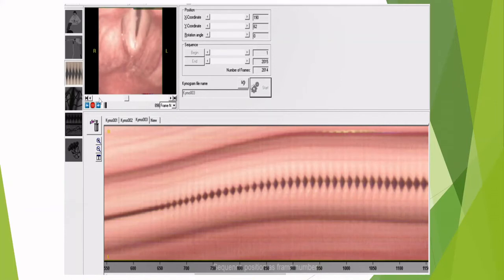We earlier showed you electroglottography, and these two together give an exact closed phase. What is interesting in this picture is that the Kymography gives you the intonation pattern in time, and as you can see, it takes around 10 duty cycles before the Kymographic intonation pattern is stable.